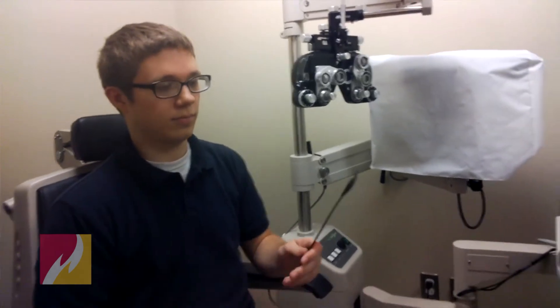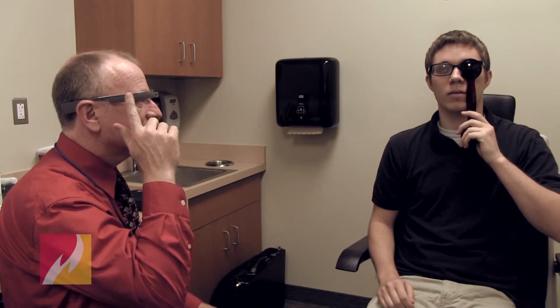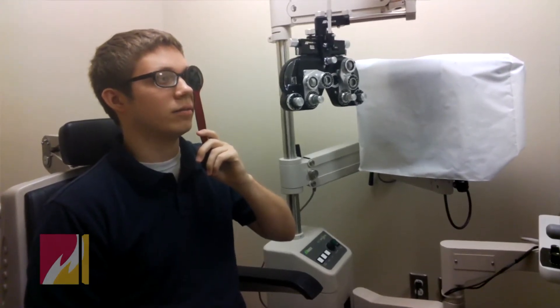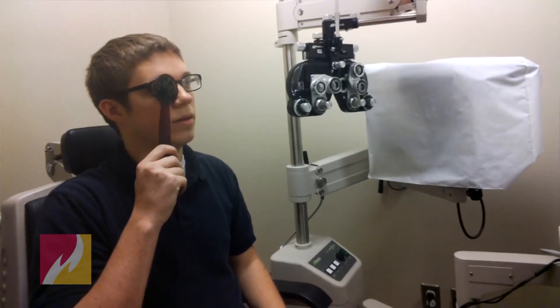The first thing we're going to do is test your vision. Take this paddle and cover your left eye. Look down the end of the room at that chart and read it for me. Z, S, P, D, C. What's the lowest line you can make out? T, L, S, V, N. Now cover your other eye — same thing, what's the lowest line? T, L, S, V, N. Any on the next line at all? No. And now with both eyes: T, L, V, V, N.